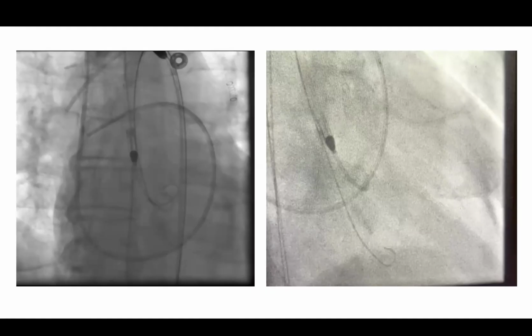And the thing is, if you push this, and it's happened, the Impella can kink on its own, and that's a problem. Then you cannot even get it out. Then you have to start snaring things or sometimes surgery. It's not easy to get it through the aortic valve because it's bulky. You've got a lot of slack here, and then it starts to kink right at the outflow every time you push.